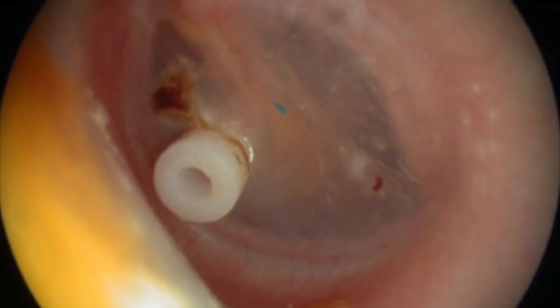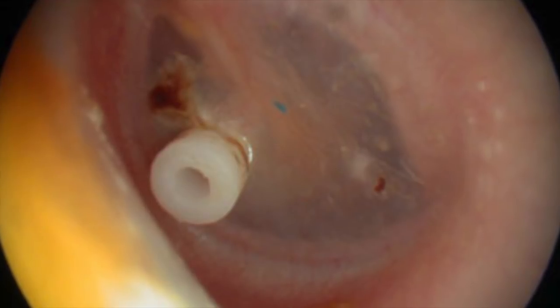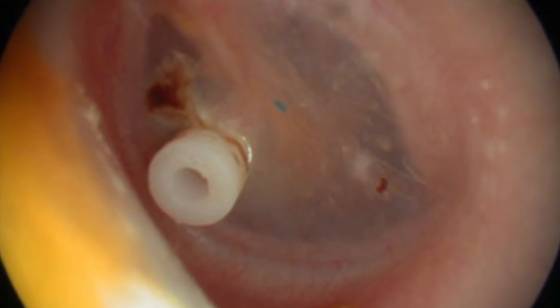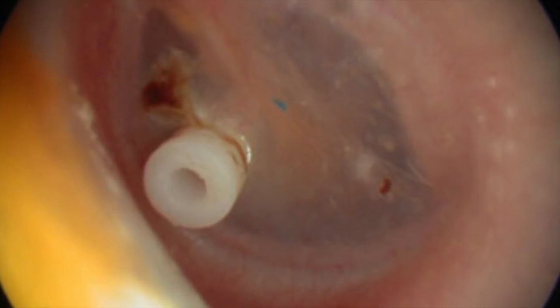Everybody got it right, so well done on the commenting. There you go — that's what one looks like when it's in the eardrum. The eardrum will naturally repair itself and then push this grommet out into the ear canal, which is what happened with that client you saw the other day. And they just sit in the ear canal until they fall out.